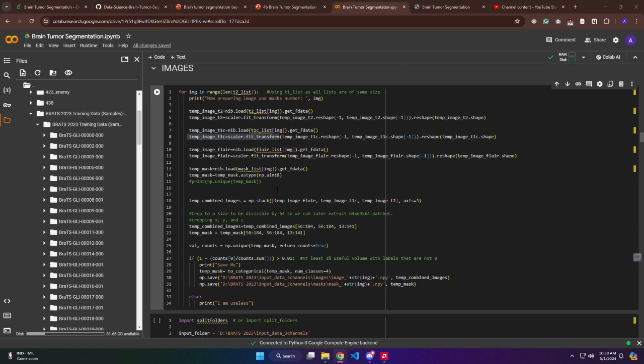In conclusion, we need to apply scaling.